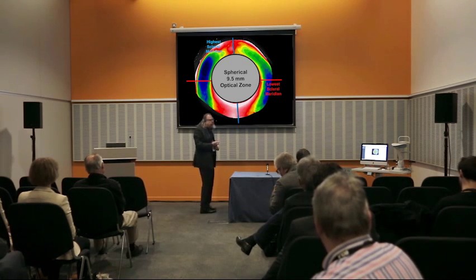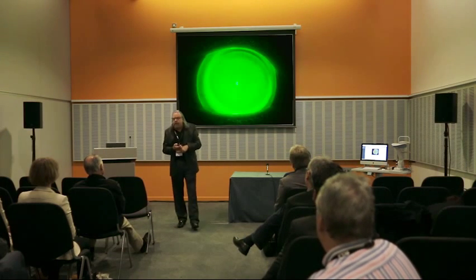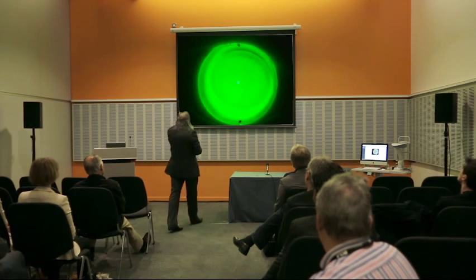Easy to see the color differential horizontally versus vertically, and now when we place the toric lens on this particular patient, we can see here the markers lining up at 90 degrees, and now when I reach in and spin it around to the 180, we can see here pretty quickly it begins its malalignment, or its orientation back to its normal resting position.